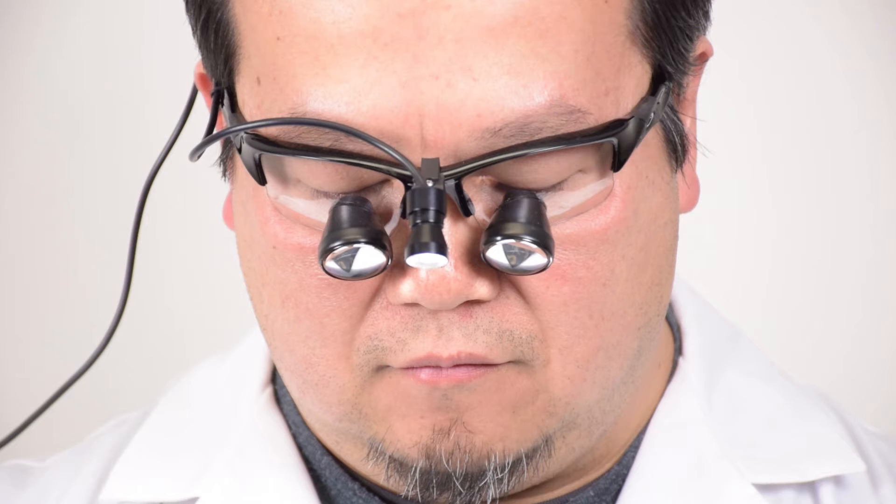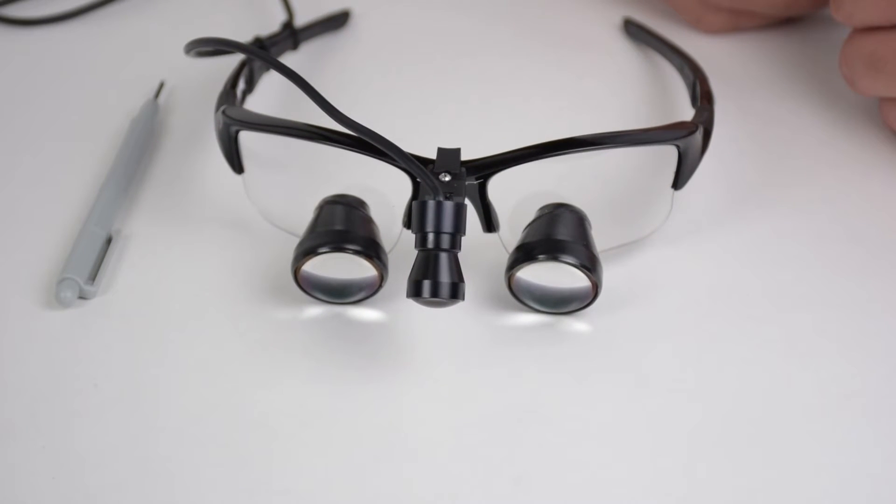To adjust your headlight beam horizontally, first try adjusting your light adapter. There are several types of light adapters for different frames. You may refer to the instructions on how to adjust your specific adapter. Regardless of your adapter, the adjustment steps will be the same.